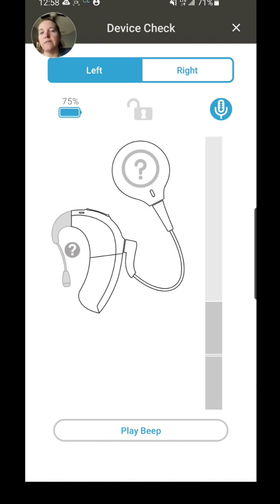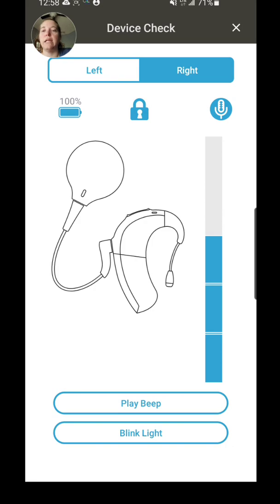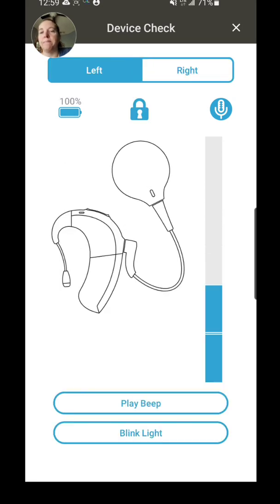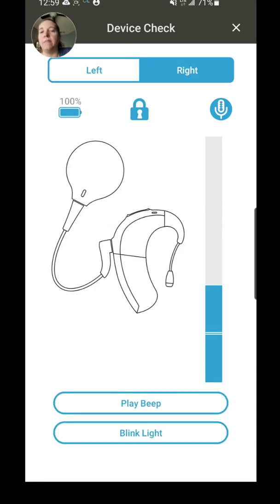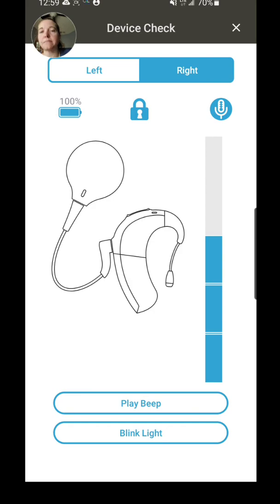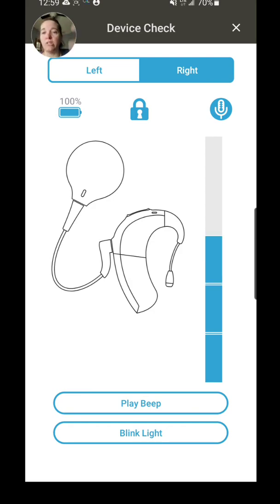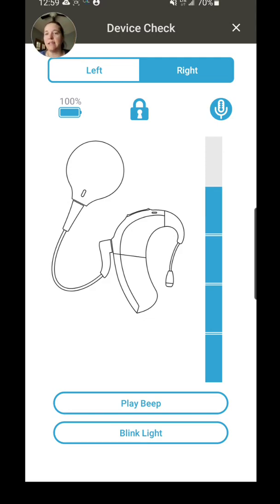And then here's the other really great aspect of this app: the Device Check. So it gives you the ability to check between left and right devices, and it will tell you whether or not it's locked or not. So you see your battery life, you also see the microphone indicator.